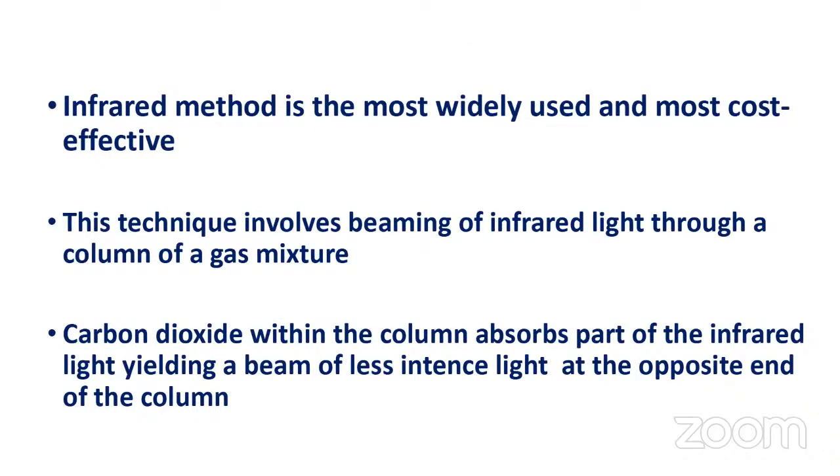Infrared method is the most widely used method, and it is most cost effective. And this technique involves beaming of the infrared light through a column of gas mixture. The carbon dioxide within the column absorbs part of the infrared light, which yields a beam of less intense light on the opposite side of the column.